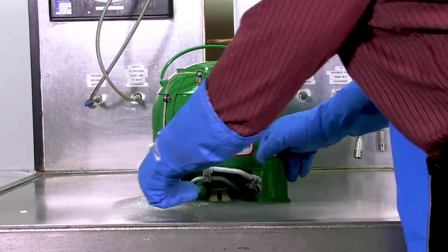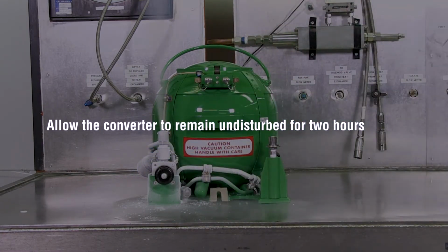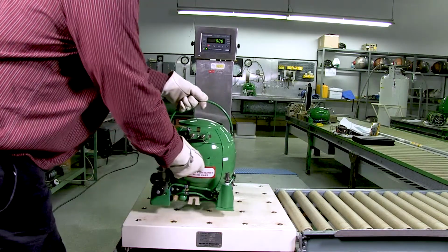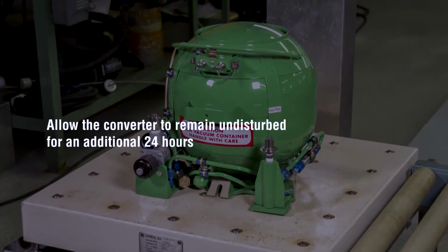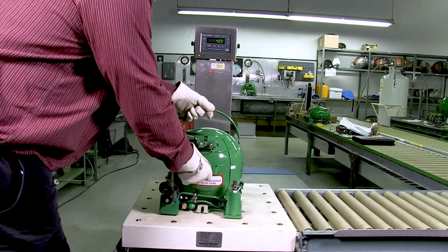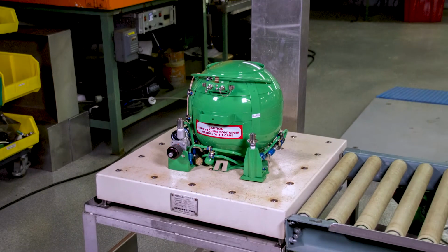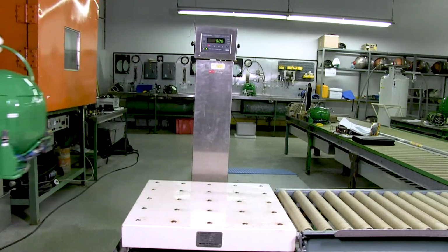Connect the vent cap to the filler port and allow the converter to remain undisturbed for 2 hours to let temperature stabilization occur. After the 2-hour stabilization period, weigh the converter and record the weight. Allow the converter to remain undisturbed for an additional 24 hours. After the 24-hour period, weigh the converter again and compare the difference in weights. The loss in weight should not exceed 3 pounds for the 24-hour period. If this test is unsuccessful, return the unit to Essex.